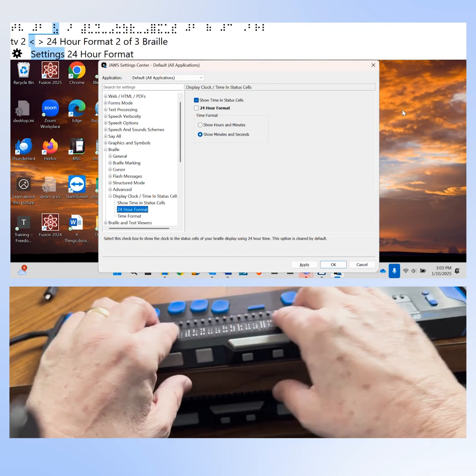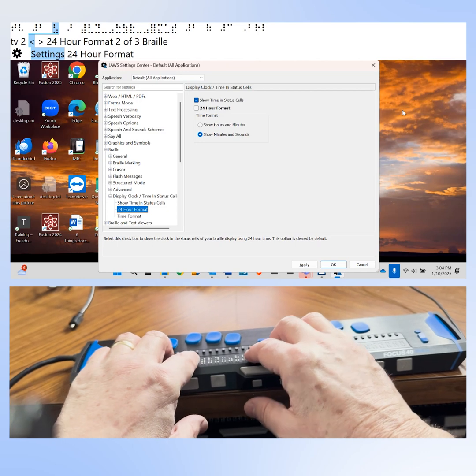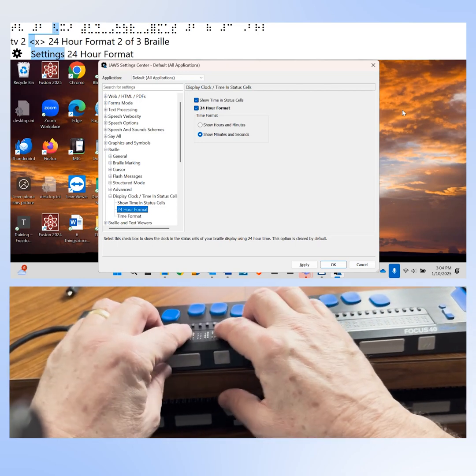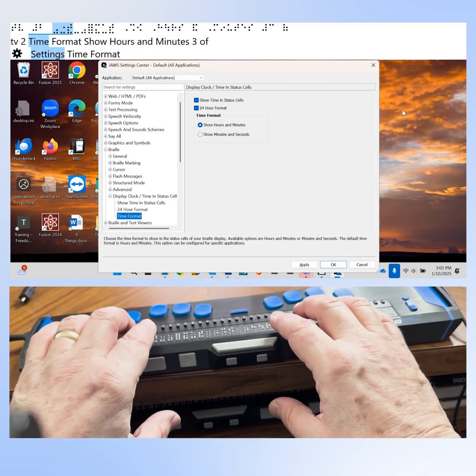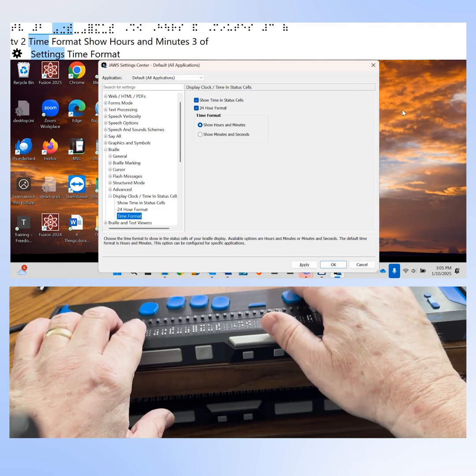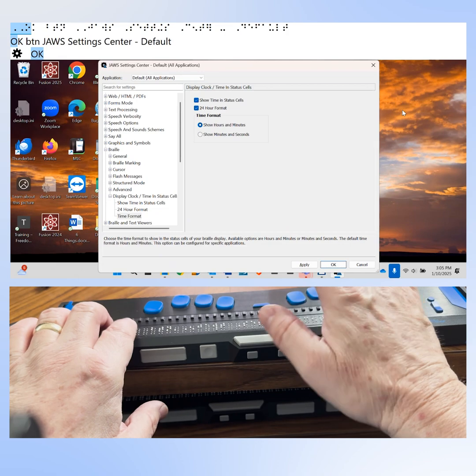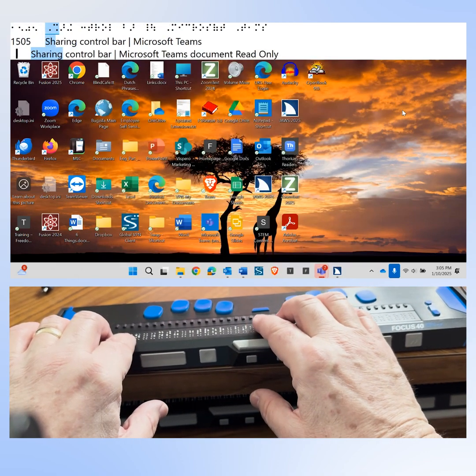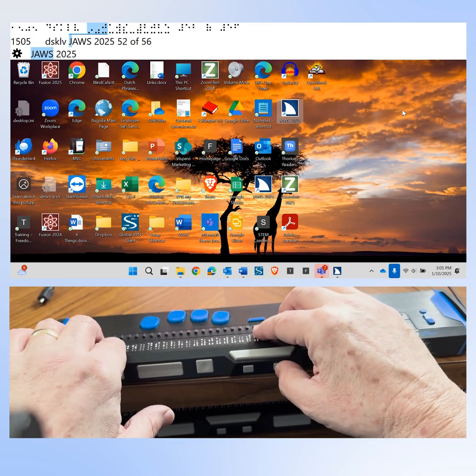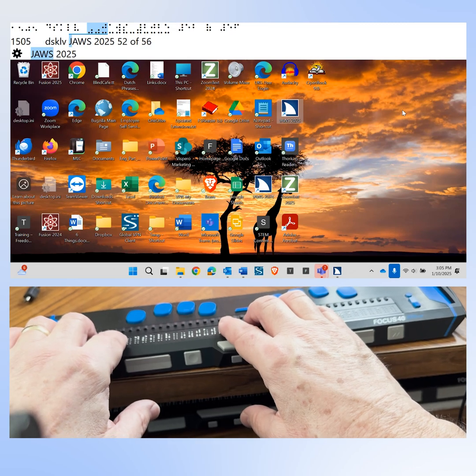The next option is 24 hour format, currently not checked. I can decide whether I want 12 or 24 hour format — I like 24 hour format, so I'm going to check this box by pressing space. Once we've set up the display the way we want, we can tab to the OK button and press space to apply. At the left end of the display you can now see the time in hours and minutes view. Using 24 hour time, right now it's 15:05.